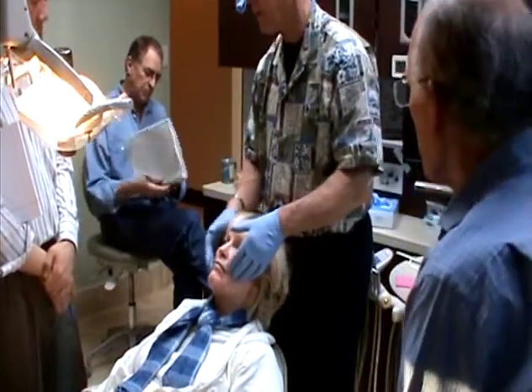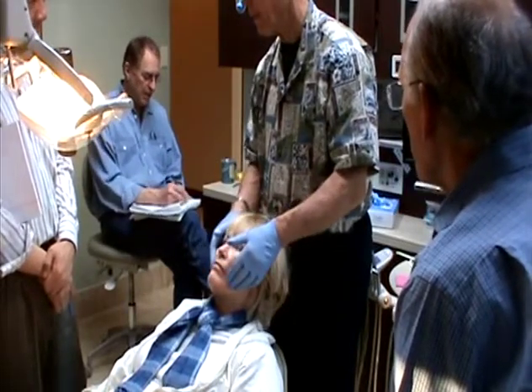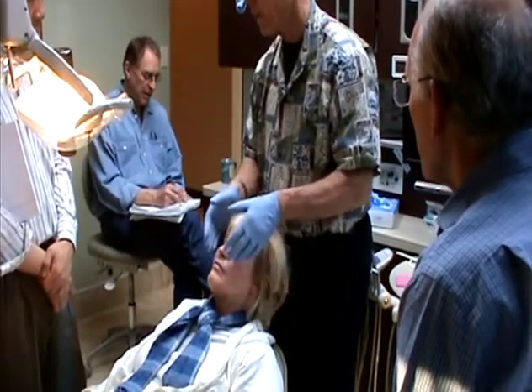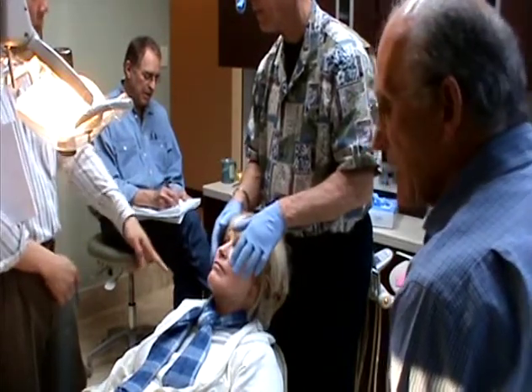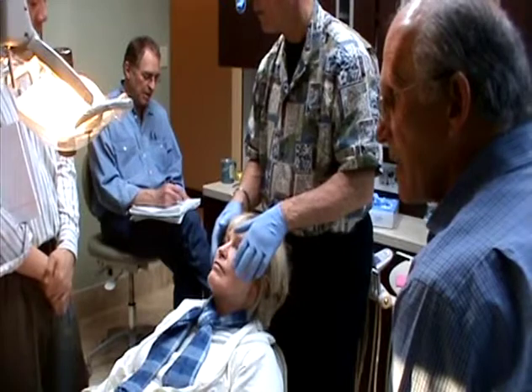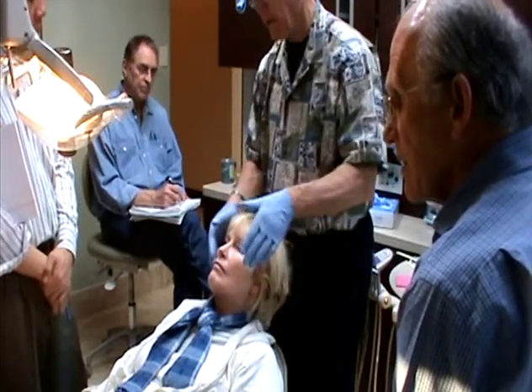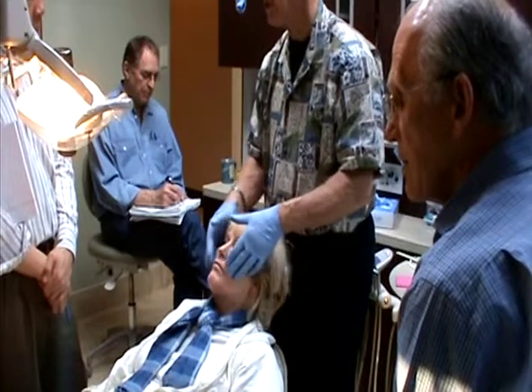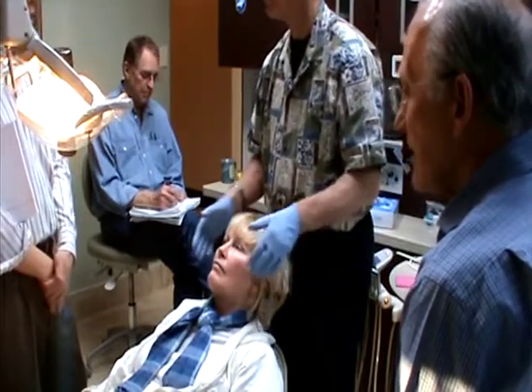And if you do a lower L, now you've got expansion here with the elastics here, you've got more expansion on this side than this side. You've got more pressure on the right than the left. So the ALF is going to expand her more on the right than the left, on the mandibular side. But if you keep her in a good wire here and put it to the inside and get this out where it belongs, then you can do equal expansion on the lower, equalizing the pressure.